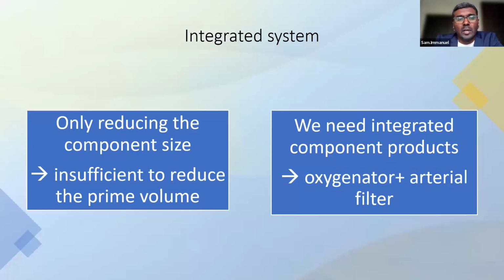As I said before, nowadays we have integrated components, because an arterial filter is needed and we need to bring down the circuit level and all those things. It is the current update in pediatric perfusion strategy.